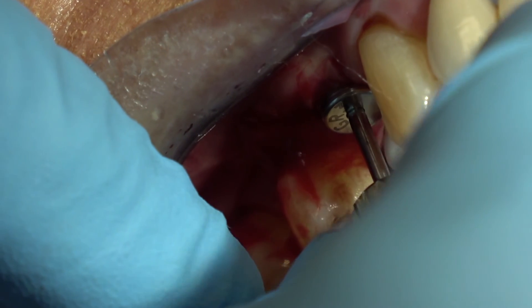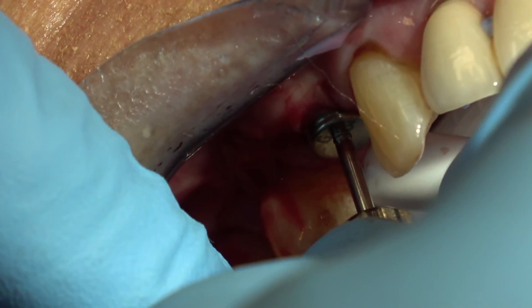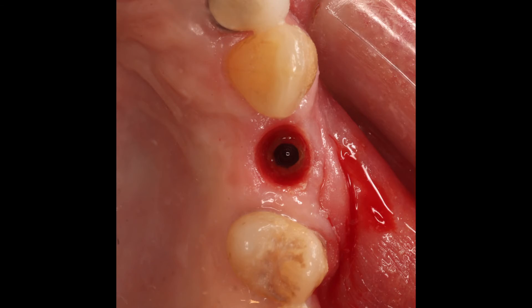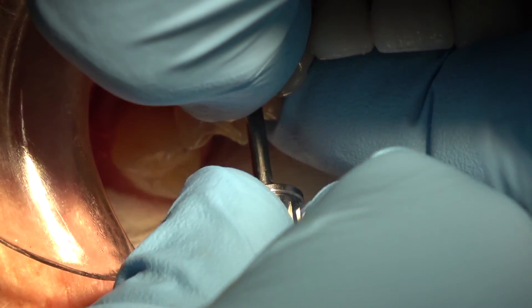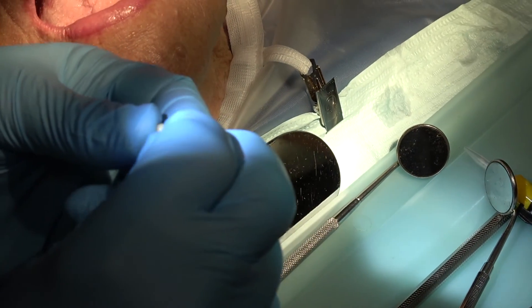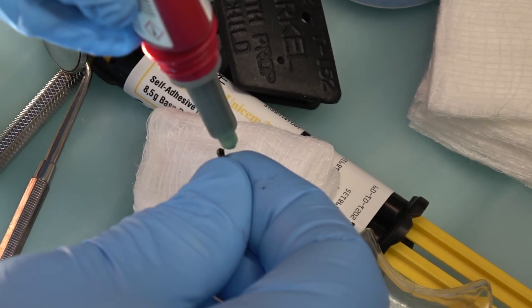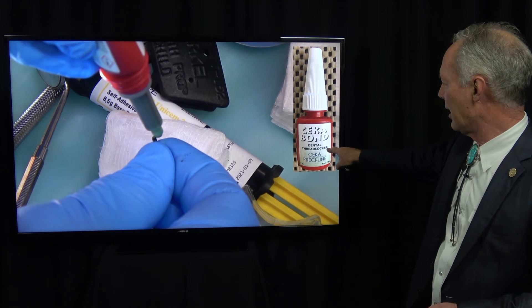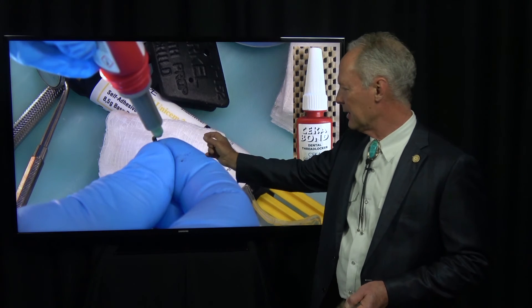A large healing cap is placed in the implant so the tissue will contour. Now we're seating the implant abutment and crown — see how the tissue has contoured nicely. This is a screw-retained abutment and crown. I'm trying it in place and taking a radiograph. Before final seating, I always like to use a new screw, because the laboratory has screwed and unscrewed the abutment on and off the model multiple times. I always get a fresh screw. This is Ceka Bond Dental Threadlocker — it keeps the implant screw from unscrewing.